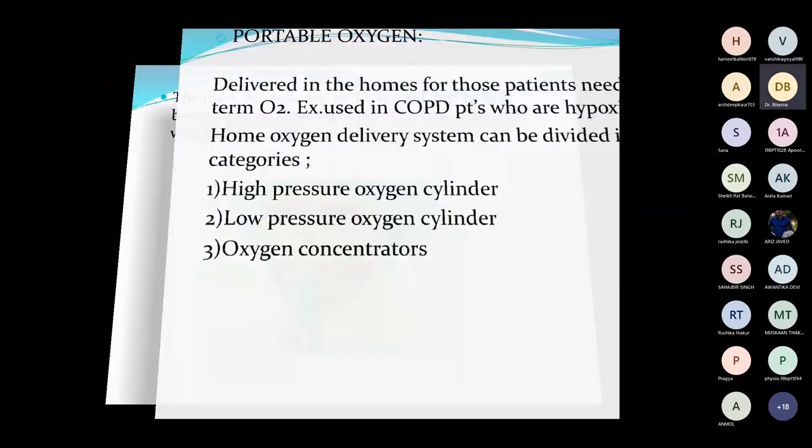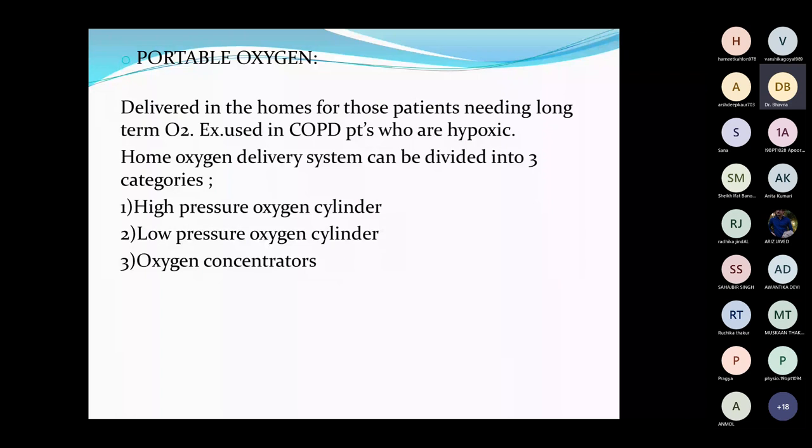Another you have is the portable oxygen. In portable oxygen, you have the cylinders where you have all the options of high, low, and concentrators, right? Because it is portable, patients can take the device at home, definitely in consultation with the doctor. The oxygen is delivered in the homes for those patients who need long-term oxygen, because long-term stay cannot be done in the hospital.